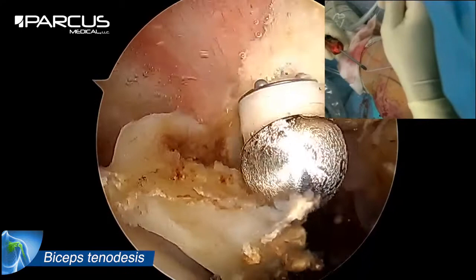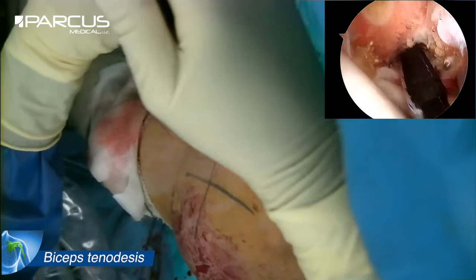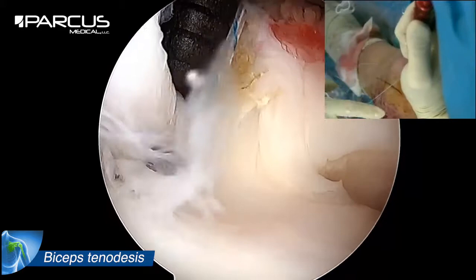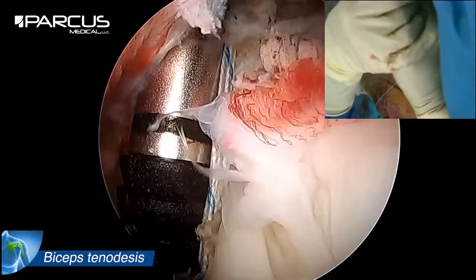The Pixie F anchor carrying the free end of the tendon is positioned in the groove which has been shaved, at a distance from the cartilage of the humeral head. The laser mark makes it possible to impact the anchor in hard subcortical bone for maximum hold.